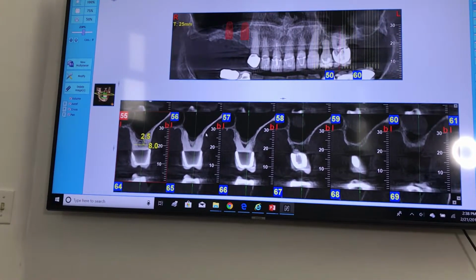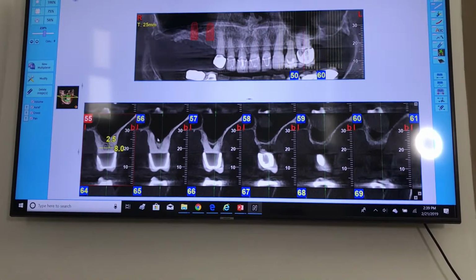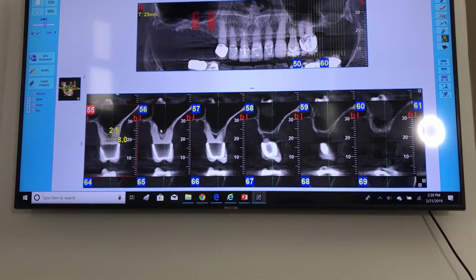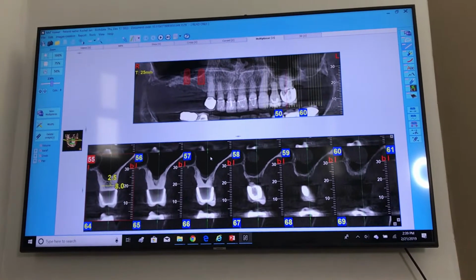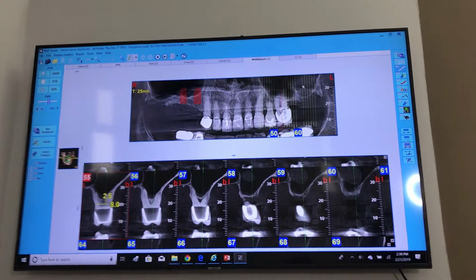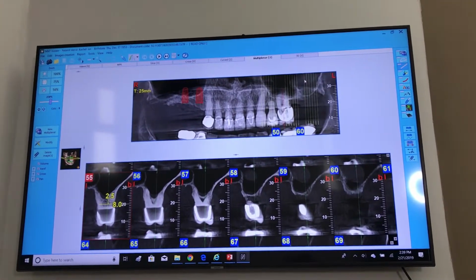It's a membrane that protects the sinus, but in this case, this membrane is fused to the roots, so it limits the movement if I want to lift it up, because it's attached to the roots. It would rupture. Exactly. And when there's an infection, this membrane gets contaminated, which is exactly this. But how or why is it that big? Because the contamination makes a callus tissue, and this callus tissue can grow. Thank God, it is not in all the sinus. It's just in a part.